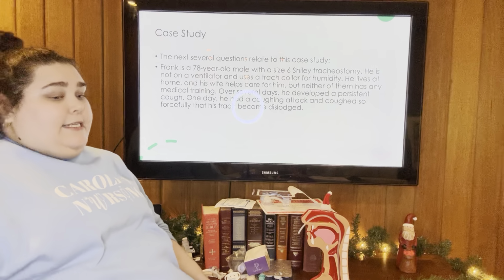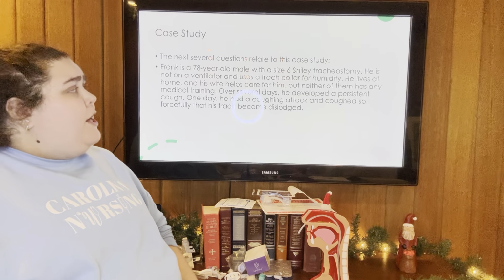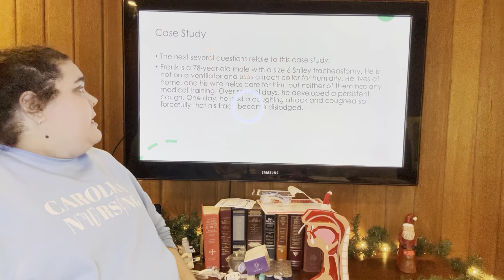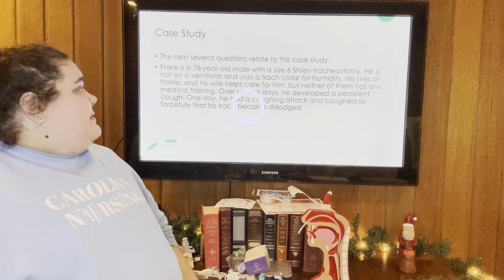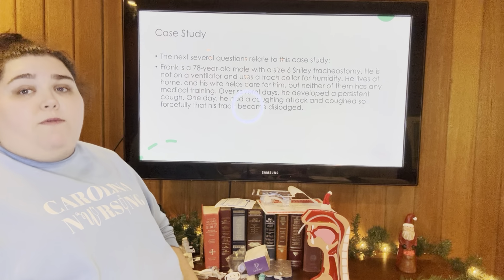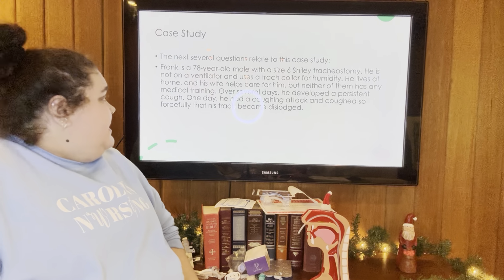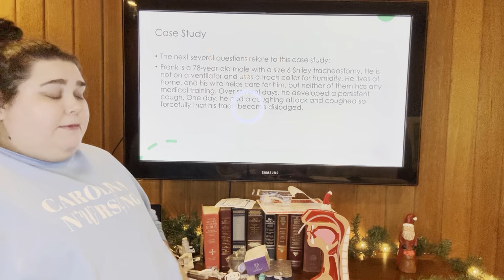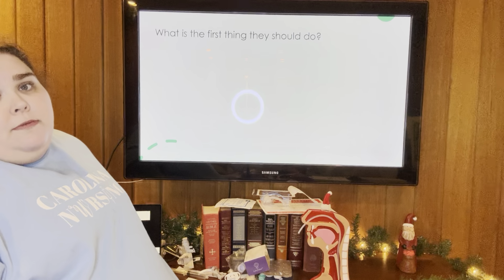So we're going to do a case study here. The next several questions relate to this case study. Frank is a 78-year-old man. He's got a size 6 Shiley tracheostomy. He is not on a ventilator and he uses a trach collar for humidity. He lives at home and his wife helps care for him, but neither of them has any formal medical training. Over several days, he's developed a persistent cough. One day he had a coughing attack and coughed so hard that his trach became dislodged. What is the first thing they should do?